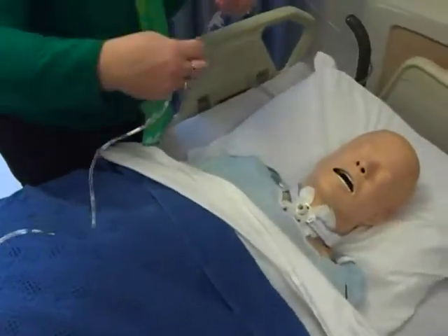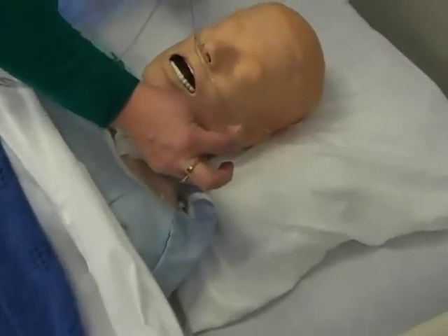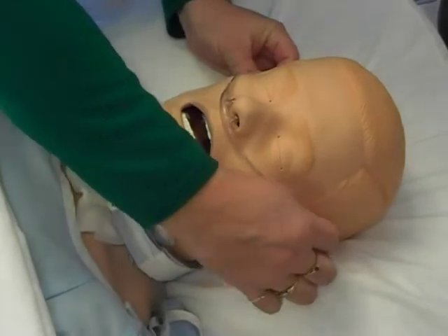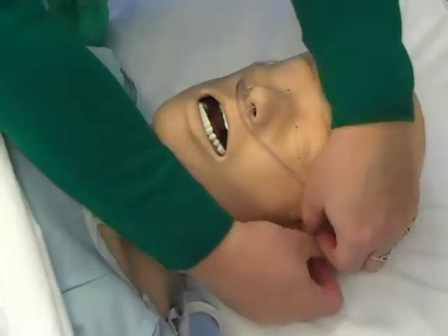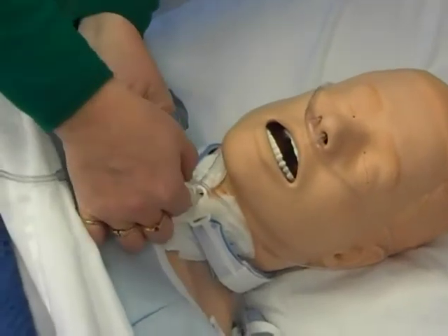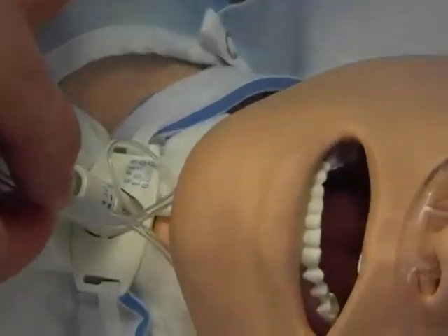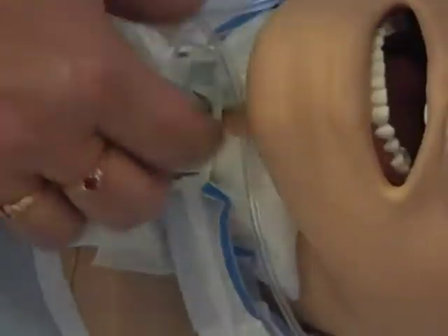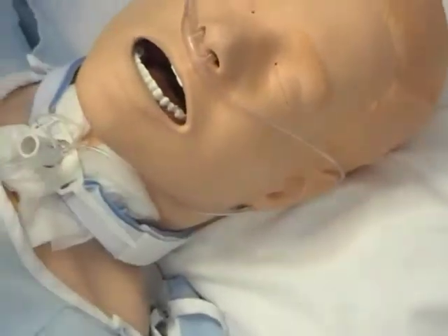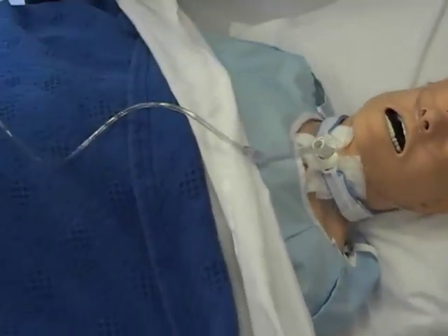You simply put it into the nostrils — remember, prongs down — into the nostrils of the patient, around the ears of the patient. And then there's an adjustment here that you just slide up and down to make it a snug fit. If this wasn't a mannequin, it would stay on the ears better. So that's how you initiate oxygen using an oxygen tank.